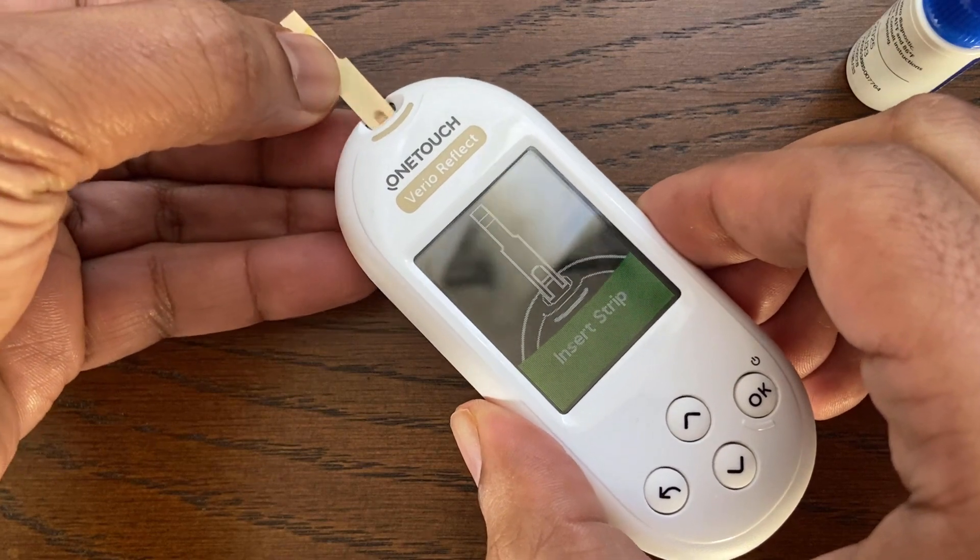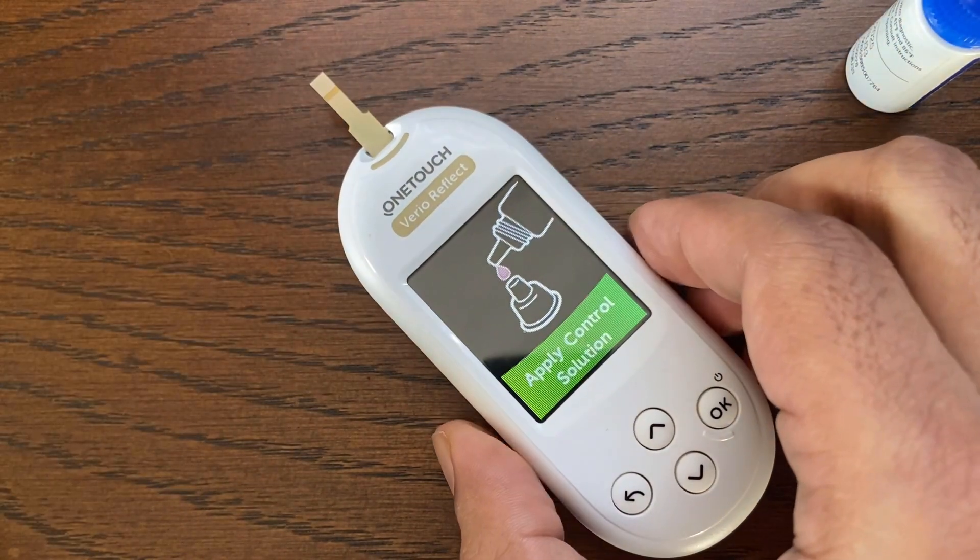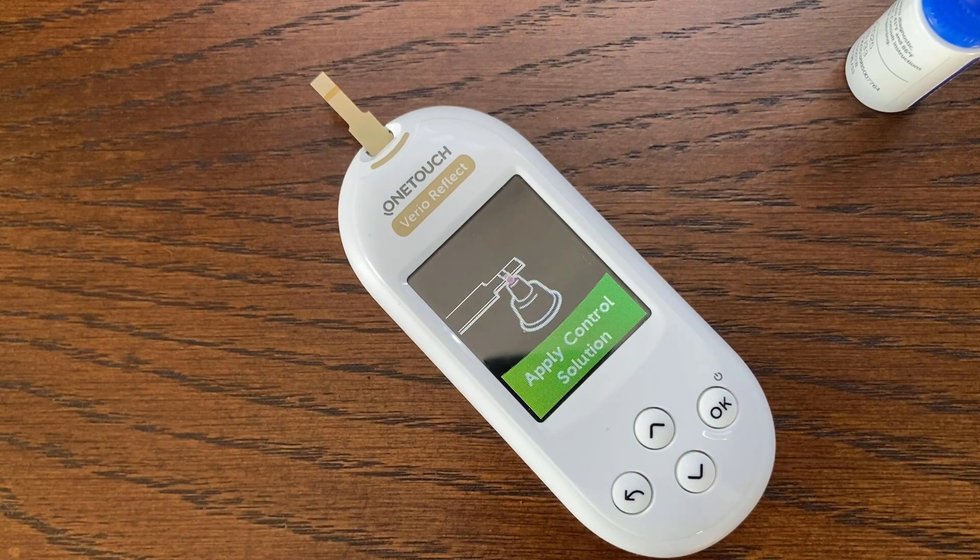Next, take a test strip out of the bottle and insert the test strip into the meter's test strip port. When the 'Apply Control Solution' message appears on the screen, the meter is ready for the test.